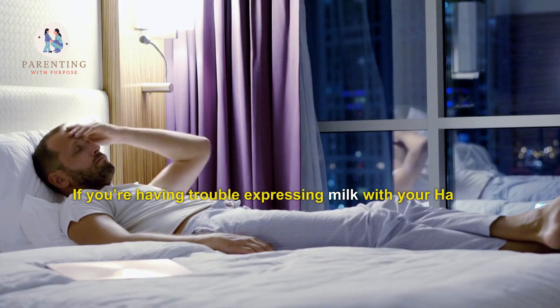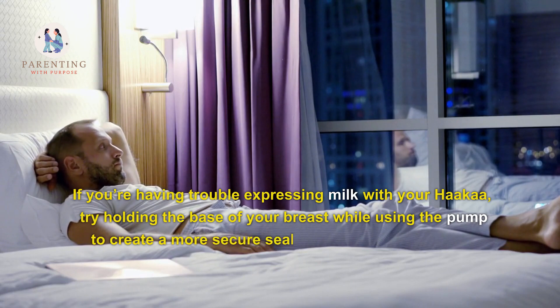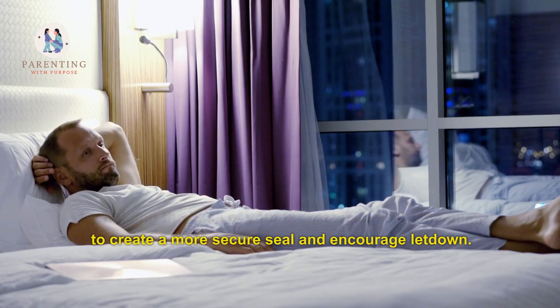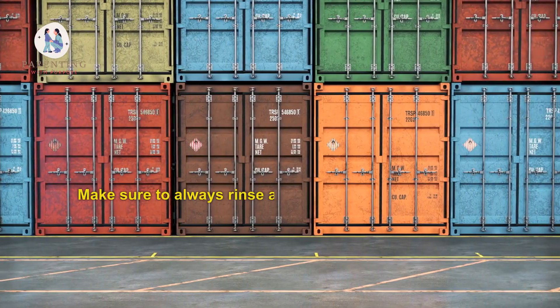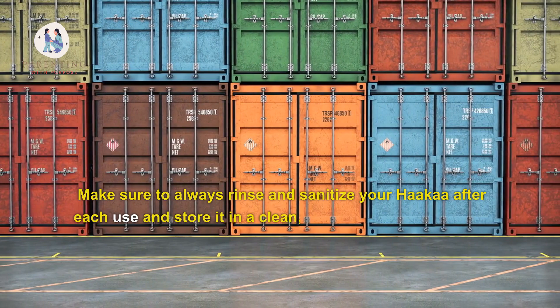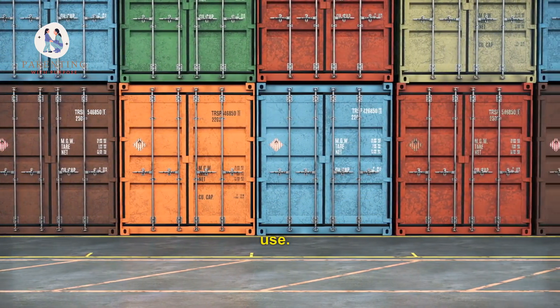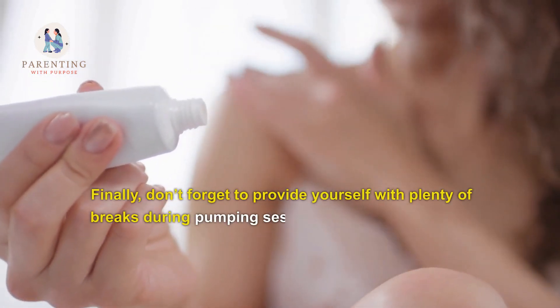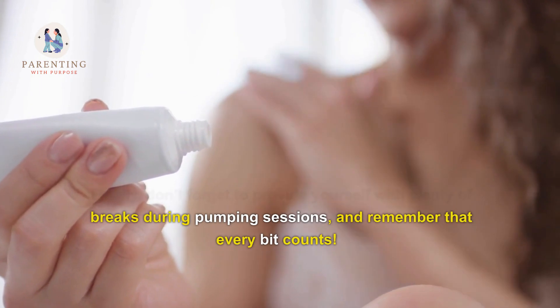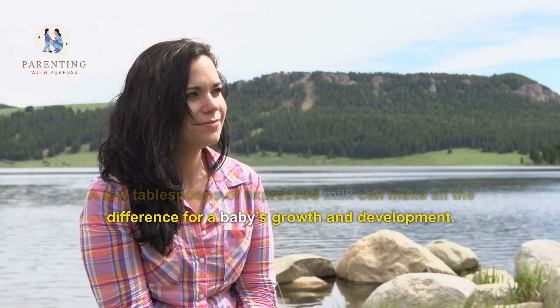If you're having trouble expressing milk with your Hakaa, try holding the base of your breast while using the pump to create a more secure seal and encourage let-down. Make sure to always rinse and sanitize your Hakaa after each use, and store it in a clean, dry container when not in use. Finally, don't forget to provide yourself with plenty of breaks during pumping sessions, and remember that every bit counts — a few tablespoons of expressed milk can make all the difference for a baby's growth and development.